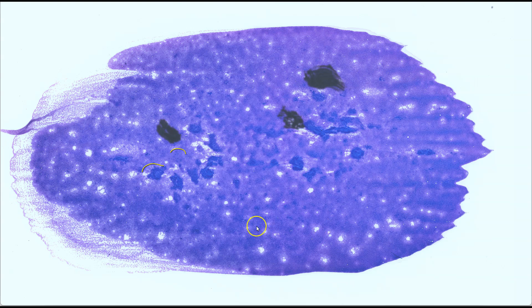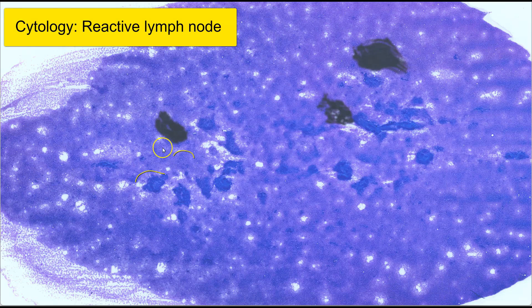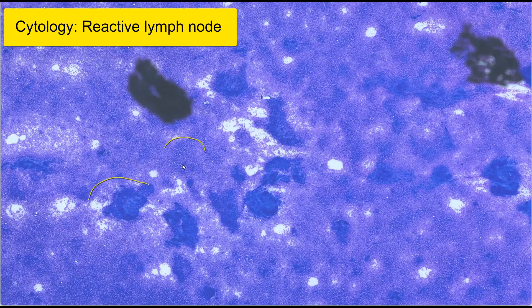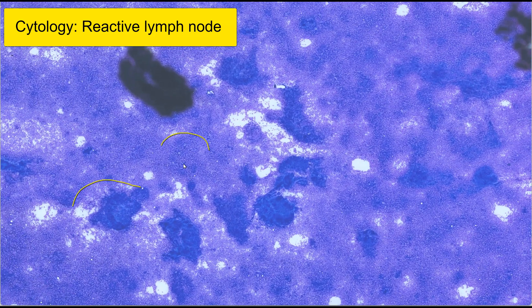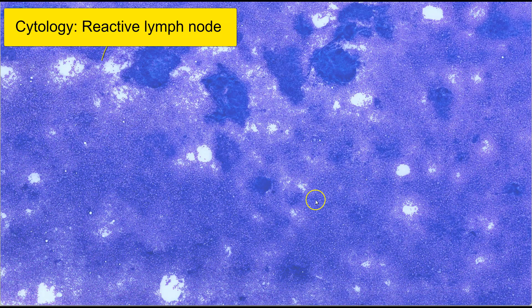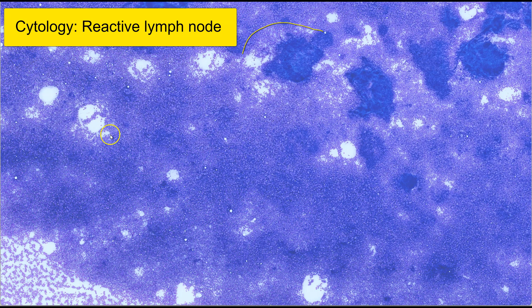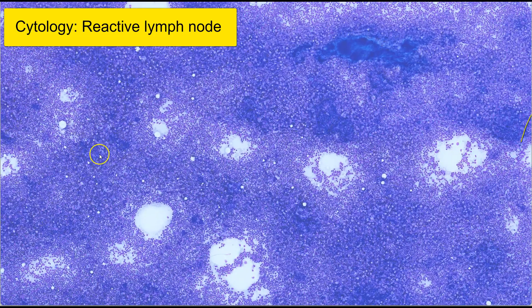Hello, this is a virtual microscopy slide of an FNA of a reactive lymph node. We are looking at the air-dried smear, and this particular smear is stained with the haemocolor stain. At low magnification, we can appreciate that there are some tissue fragments, and in many areas there is actually a more dispersed population of discohesive cells. Let's look at the discohesive cells.